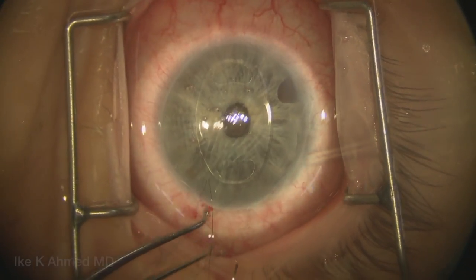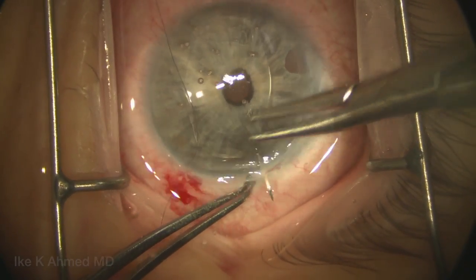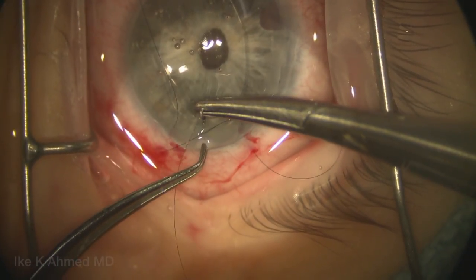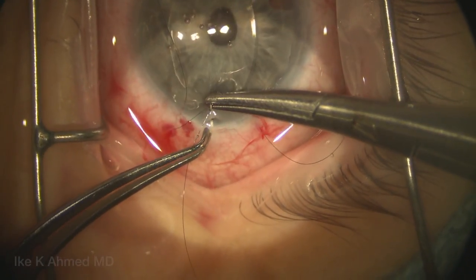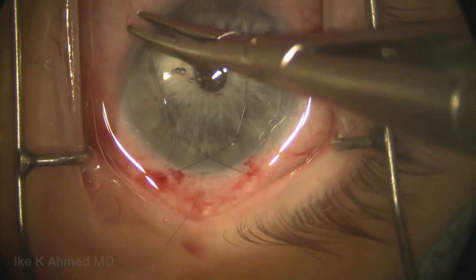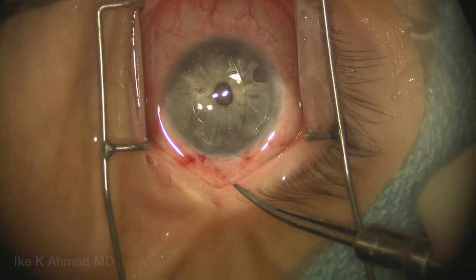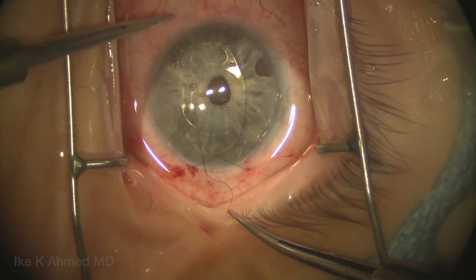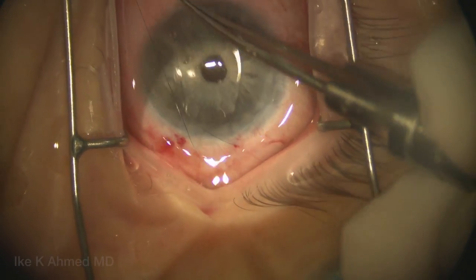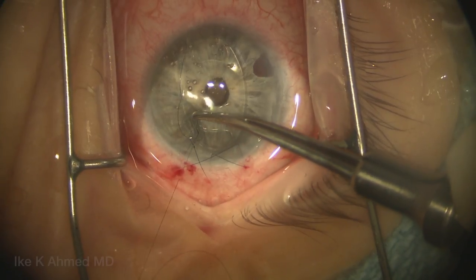Prior to doing the enclavation, it is helpful to suture that wound at least temporarily. Here we're using a 10-0 nylon suture placed in an overlapping technique using essentially 3 bites — two on either side at either end of the incision and one down the middle. We find this provides a very nice astigmatically neutral suture closure. This is a temporary tie — a triple throw initially — and then we'll create a loop suture with a reverse throw after we cinch the tie, simply to close that incision temporarily.